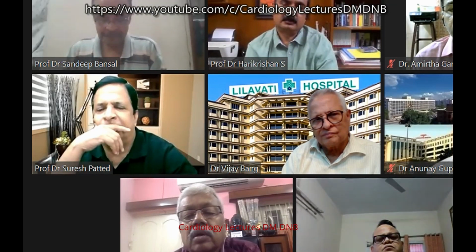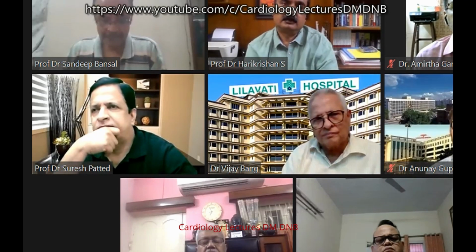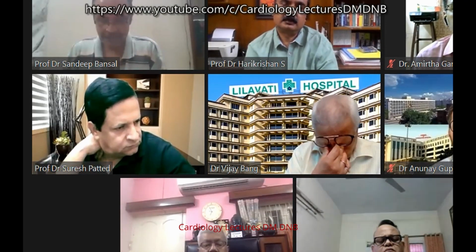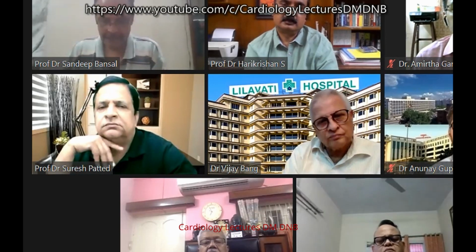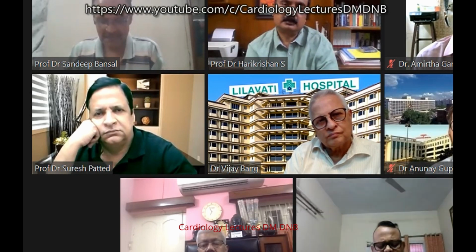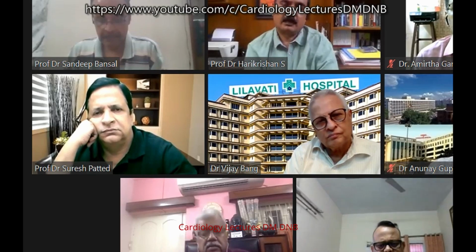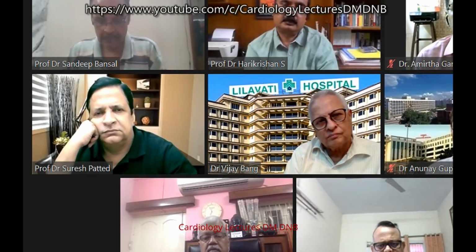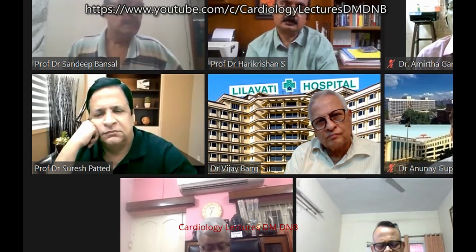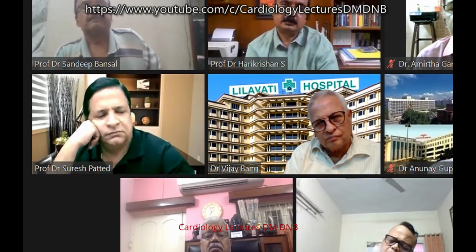No, ma'am. Generally, you don't measure it on angio because it is going to take time. You have to have the balloon in your cath lab beforehand, and it's better to go by ECHO. Yes, unless you find a very discrepant annulus on the angio sometimes, or the window is not good, that's fine. Otherwise, generally we use ECHO. So what balloon would you use for a 9 mm annulus size? 9.4 annulus, ma'am, we use up to 120% of the annulus size.